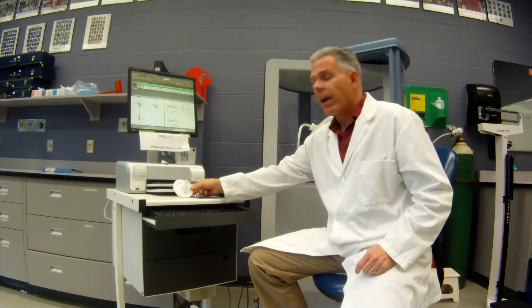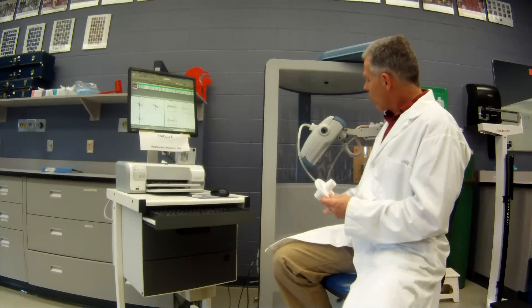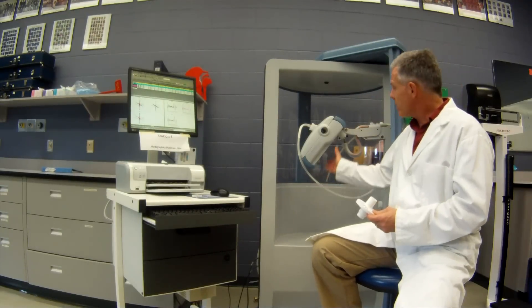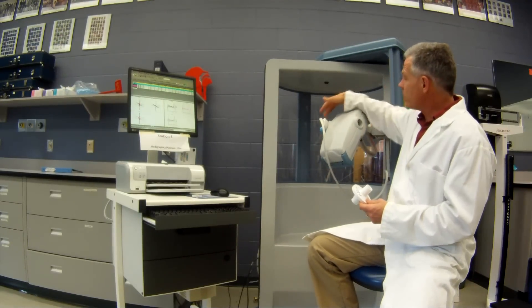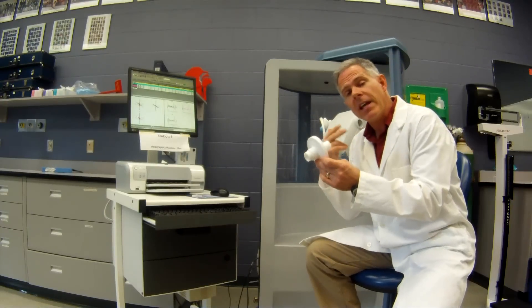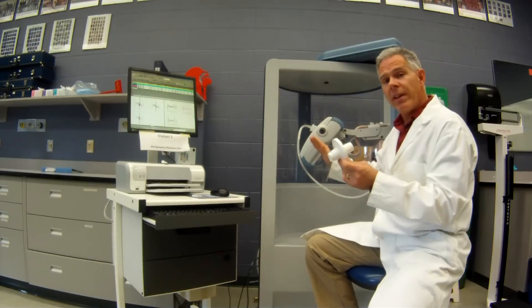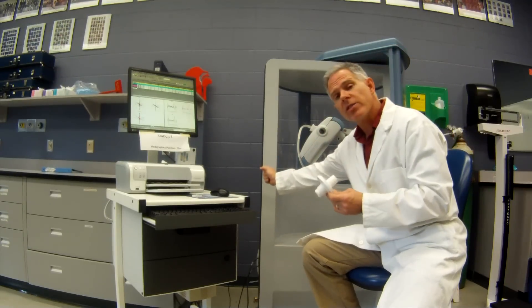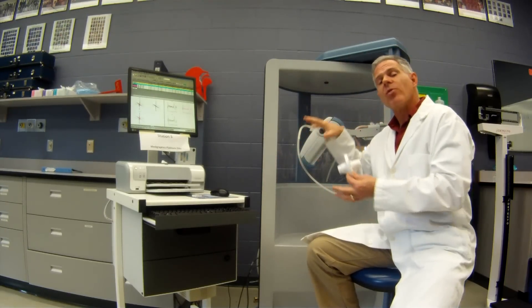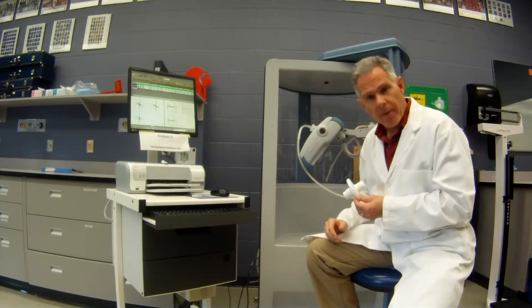With this one, like always with our patients on the body box, we're going to sit them inside the body box and they'll actually be breathing through this apparatus right here. We've got a little filter on there for them so they'll be breathing out through this filter. We're going to close the body box door and it's going to seal, so it'll sound a little unusual and the temperature will rise quite quickly, so we have to prepare them for that.